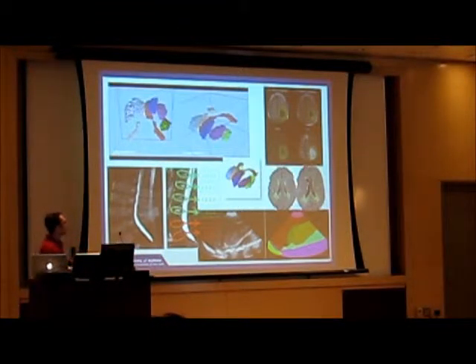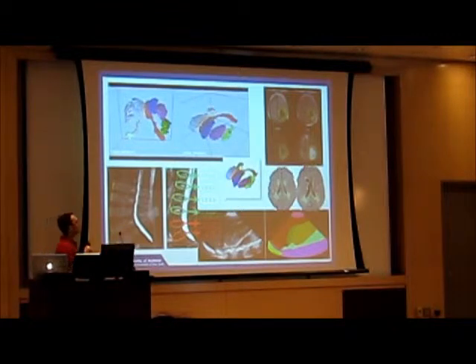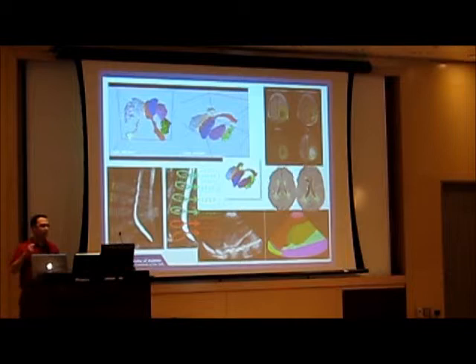The challenge here is that we not only need to segment the image, but we need to know what we're segmenting so that we can then tell the physician what's going on. Over a longitudinal study of brain tumor, has this patient progressed, has the tumor progressed, or has the tumor receded? This is quite challenging because we have to look at the images not only at a pixel scale, but at a multiple scale.